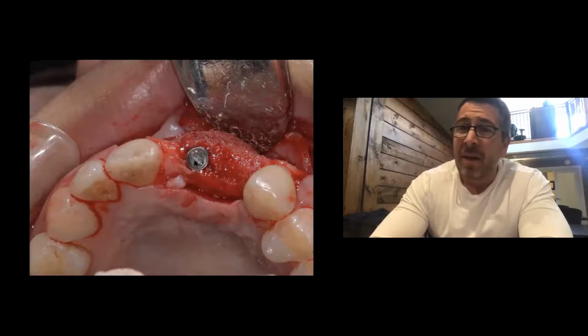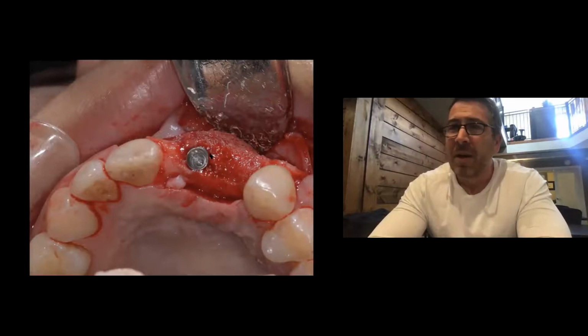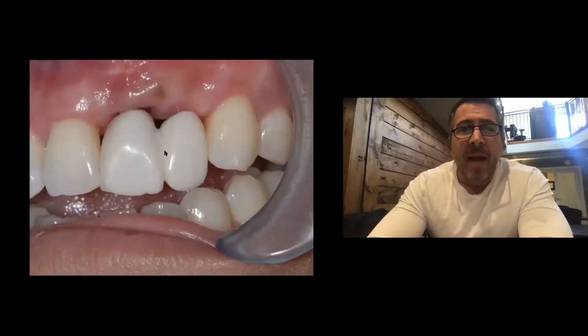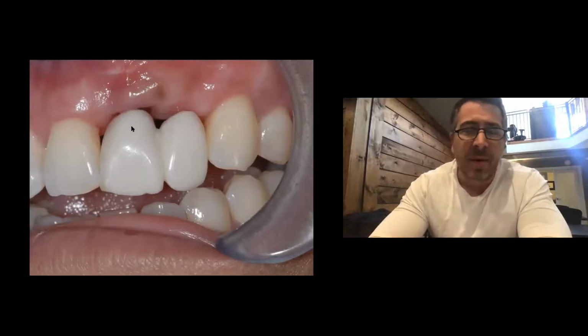We placed the implant in a nice spatial relation with lots of buccal lingual bone. Subtle detail, you'll see that I took a bit of the palatal tissue and I rolled it over to the facial to try and thicken the tissue a little bit further. And then we place an abutment and we get some temporary crowns. So it's a cantilever pontic and a temporary crown.